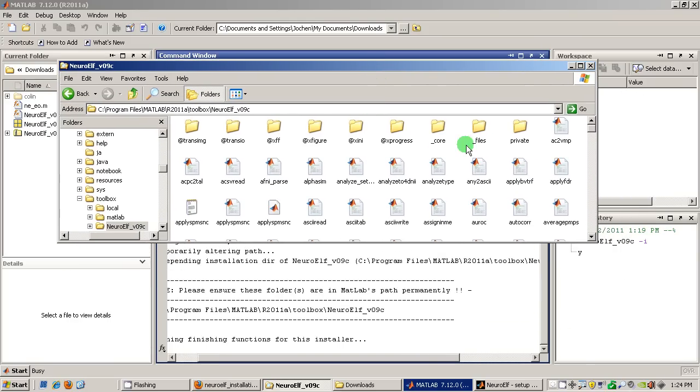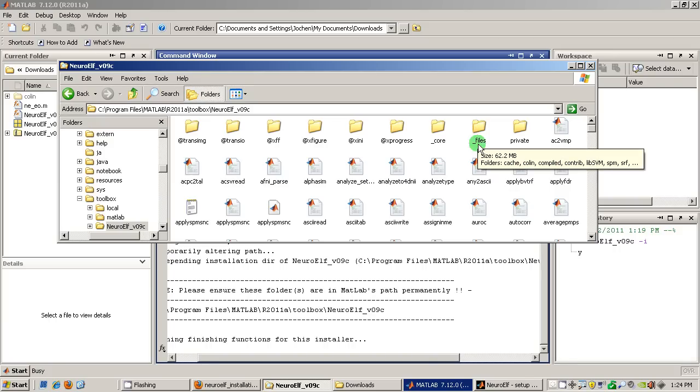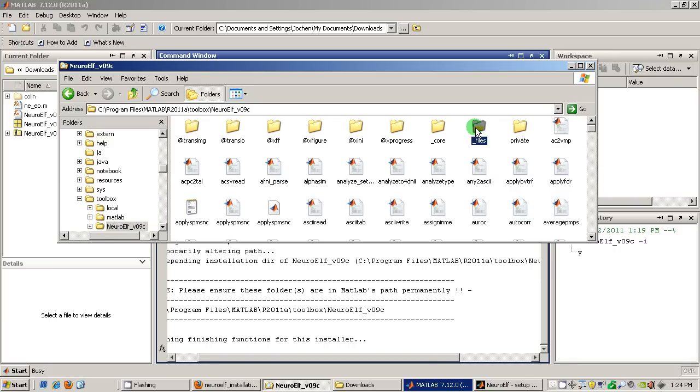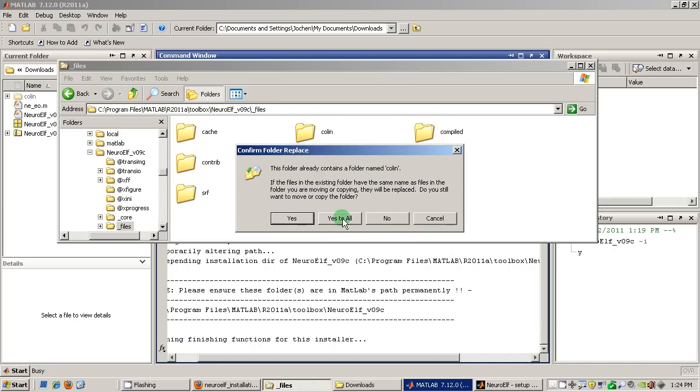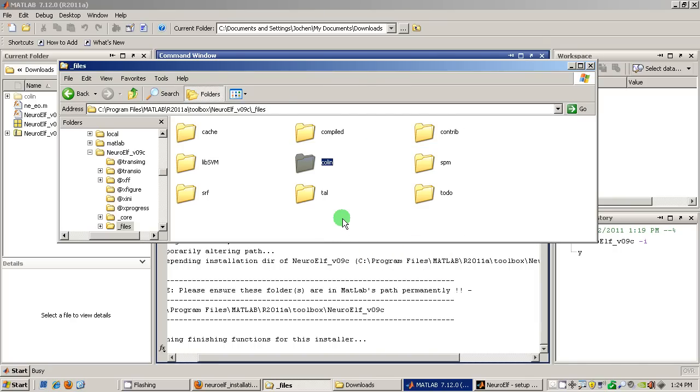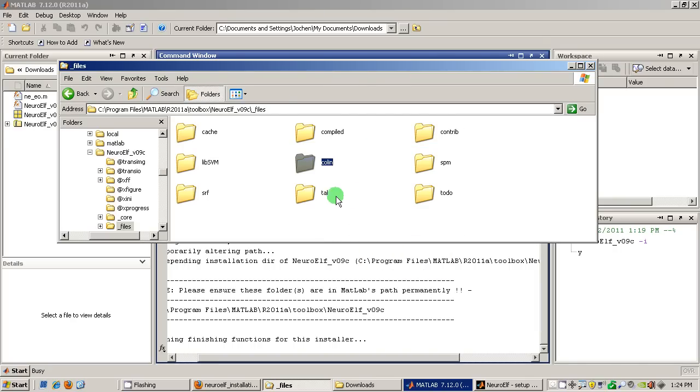And if I click into this folder I can already see that there are several folders and I will switch into the underscore files folder and there already is a colin folder but I simply say paste now and it simply puts all the files that I have downloaded already into this colin folder.